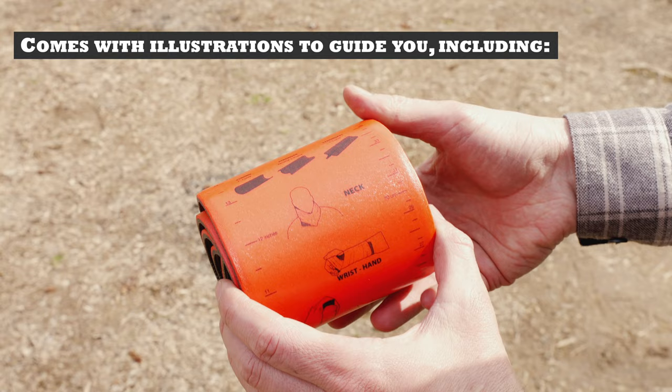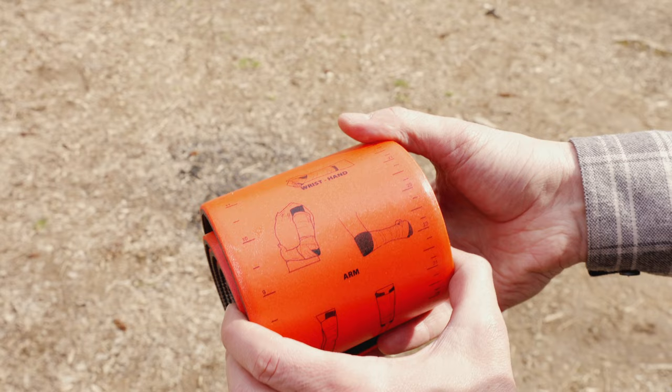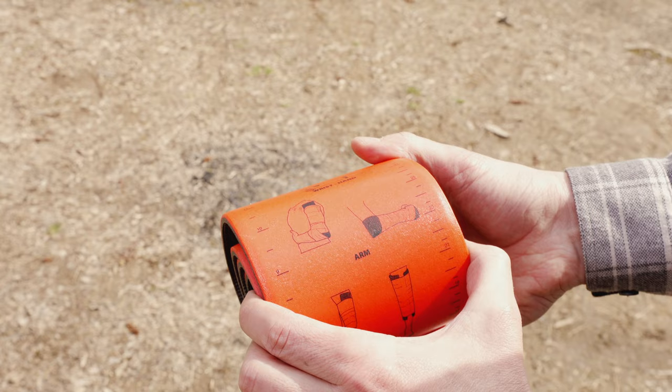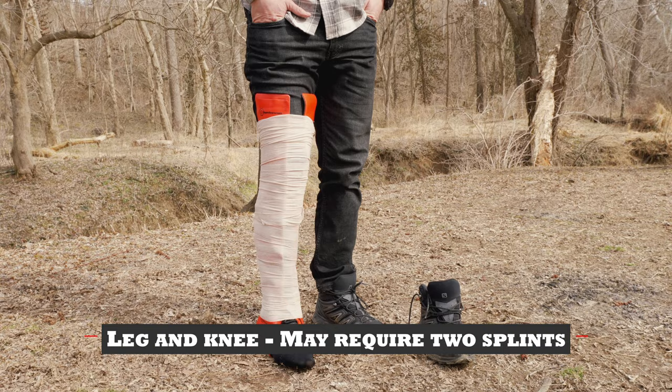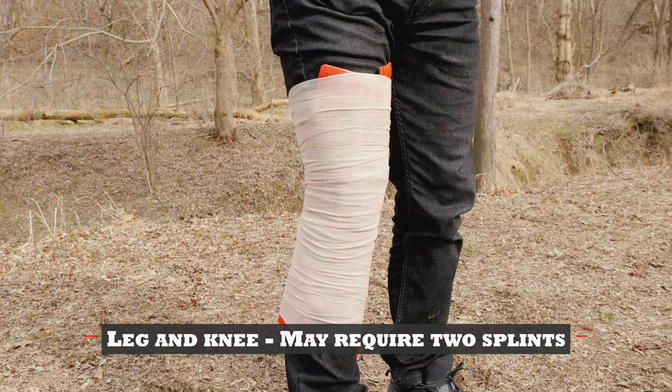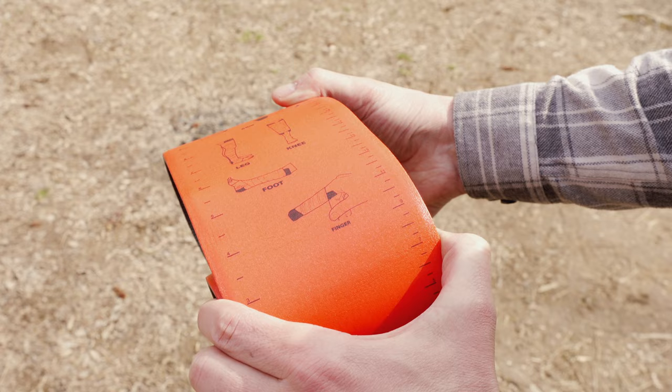such as illustrations for a neck brace, wrist and hand, arm, leg, knee, foot, and finger.